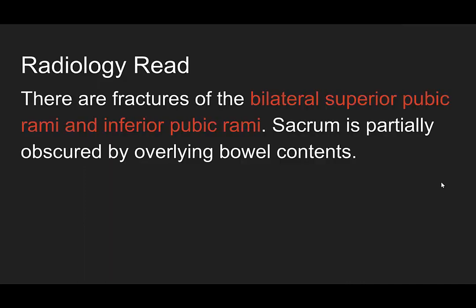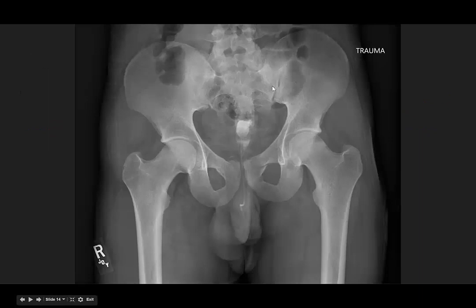There are fractures of bilateral superior pubic rami and inferior pubic rami, and the sacrum is partially obscured by overlying bowel content. You can see the patient has a Foley in place and has gotten some contrast through it, but that's not what we're looking at. Let's follow the system. We look at the iliac wings — everything looks good on both sides.